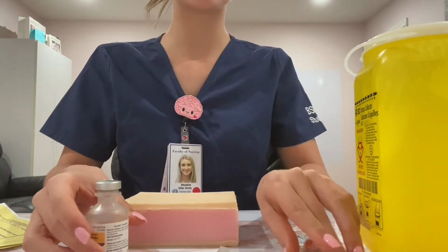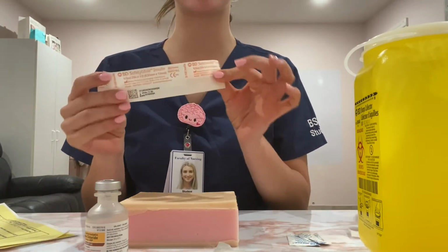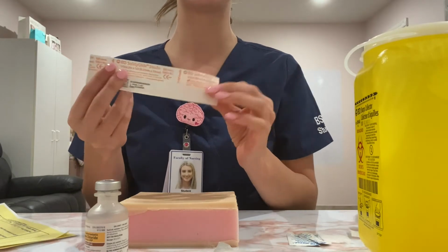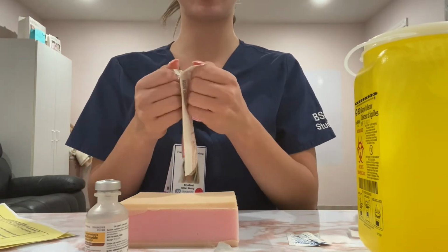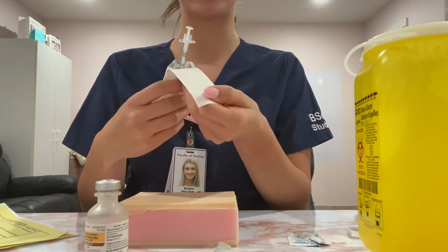Then I'm going to use the insulin syringe, which I've checked for expiration, tears, holes, shreds, and I'm going to draw the correct amount up in air. Since I don't have an insulin cartridge, then I wouldn't need to.